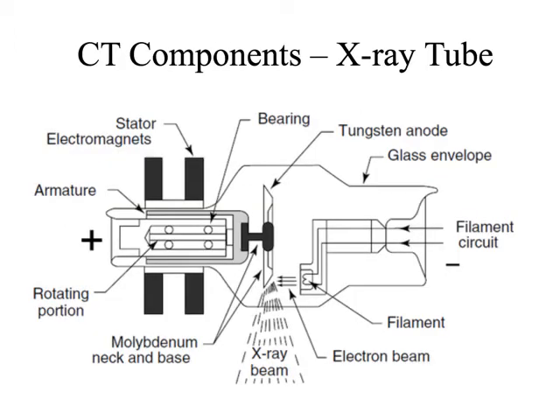So here is the X-ray tube that we're going to hook up to a turntable, right? And y'all are covering this quite a bit in your physics class, so I'm not going to belabor it too much, but it is a really helpful thing to be familiar with, and we can have kind of a show and tell with the X-ray tube here, so you can have an opportunity to look at all the inner working parts of it.